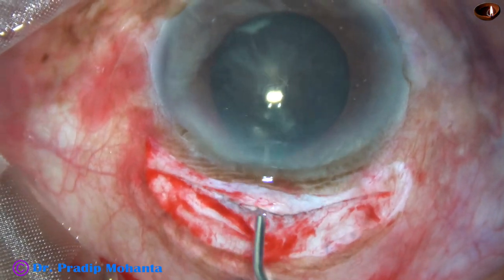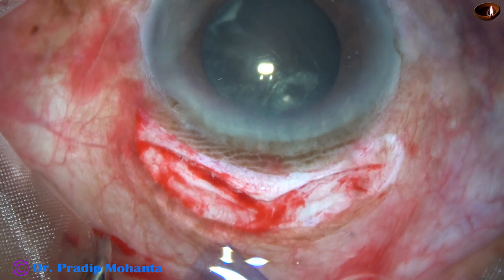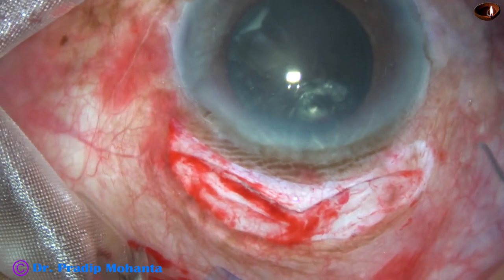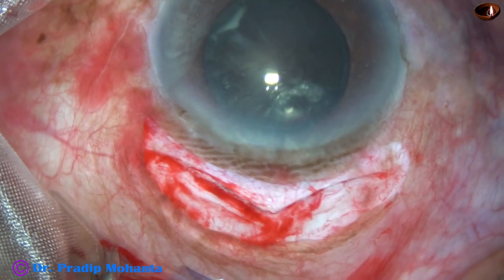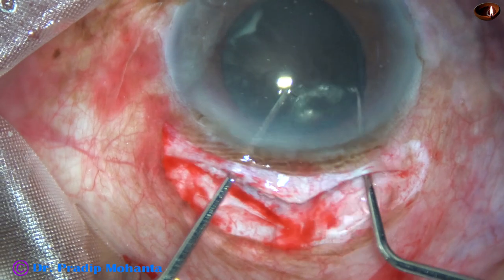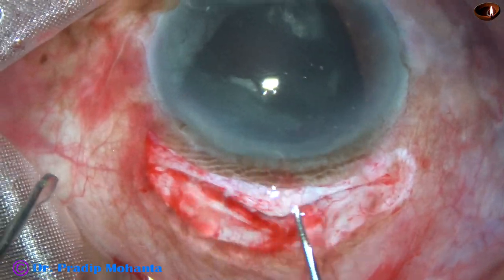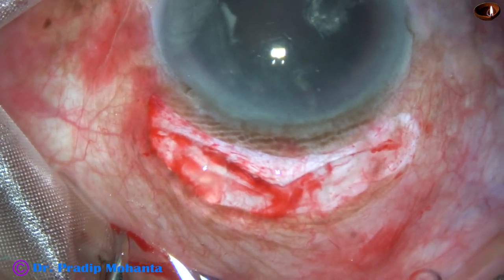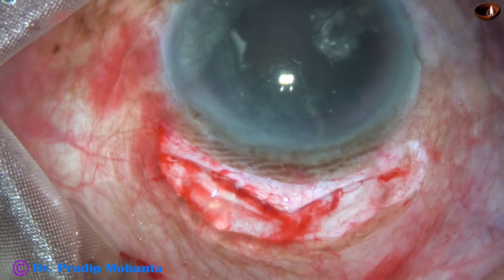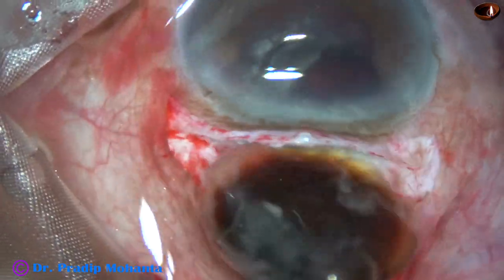Hydrodissection is done in a very gentle manner. The nucleus rotates. There is no epinucleus, very little cortex — the whole epinucleus has been incorporated into the hard nucleus. Now I am going to prolapse the nucleus out of the capsular bag with the help of two hooks. See how huge it is — it has occupied the whole of the anterior chamber. I am using an irrigating vectis to deliver the nucleus. Since the wound is large, the delivery is very smooth. Whatever little epinuclear material was there has been irrigated out.